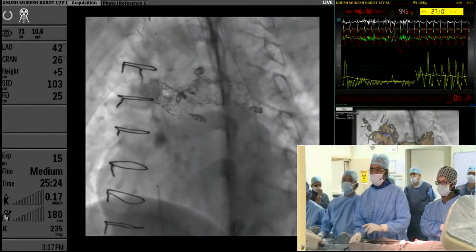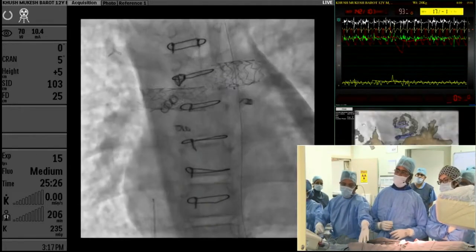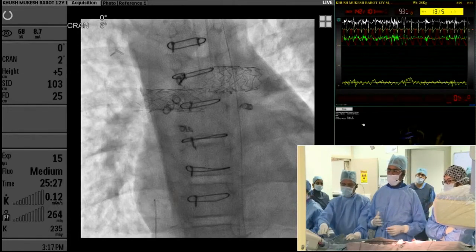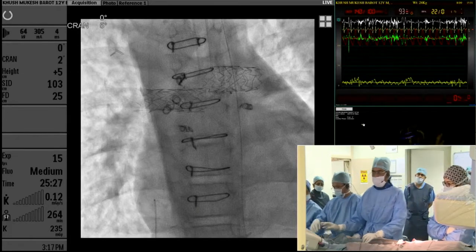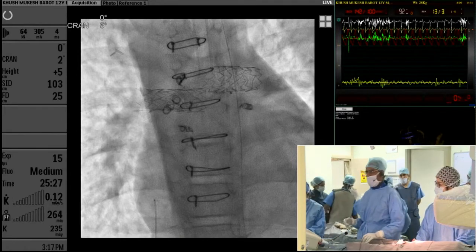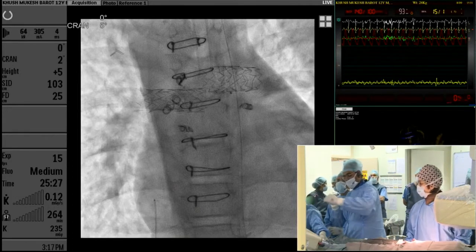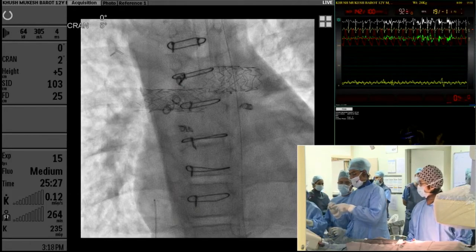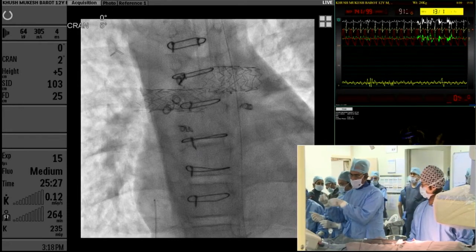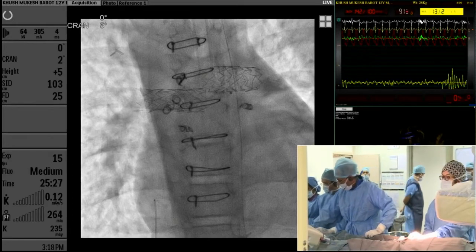Yeah, somebody suggested that in the morning. See, once you have a stent protruding into the LPA ostium, next time when you try to go in and post-dilate it, it creates some difficulty. Sometimes with an RCA catheter, the catheter will go through one of the struts and create a lot of difficulty. So I wanted to keep very little metal protruding into the main pulmonary artery. But retrospectively, maybe another 2 millimeters I could have come proximal. I think positioning has to be very optimal. If you go too deep, then you miss the ostium.